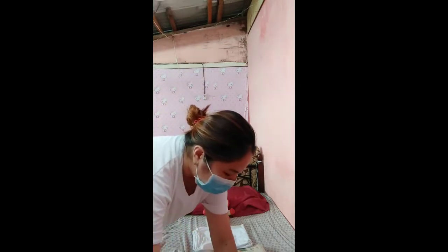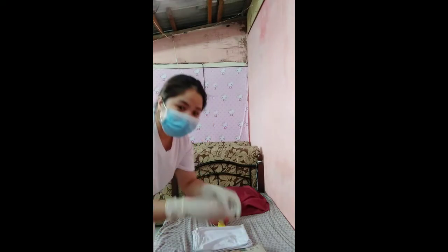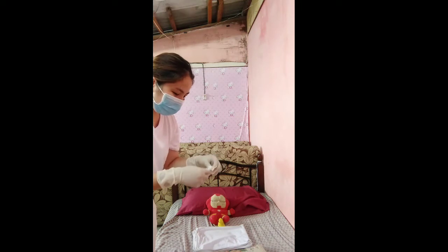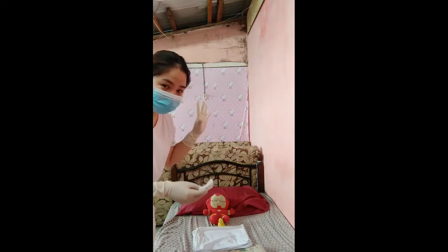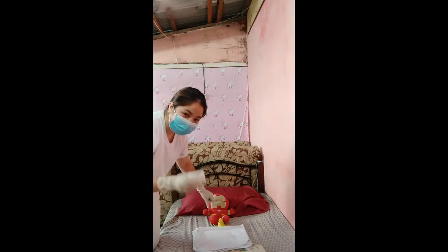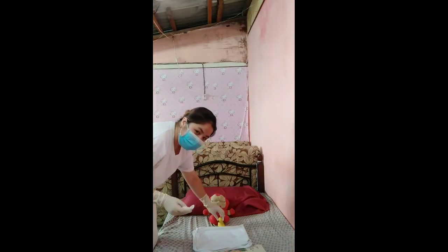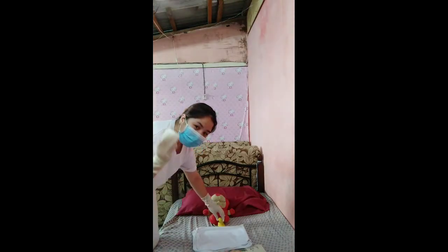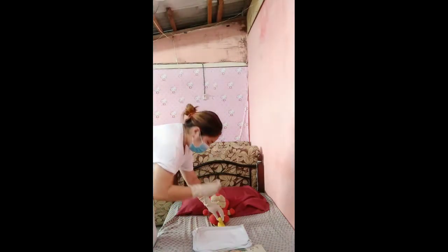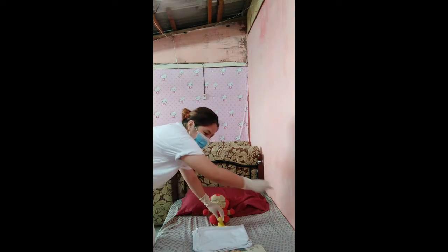So I have here 3 alcohol swabs. We assume that this is an alcohol swab. I use my non-dominant hand, and I put this on the meatus of the patient and clean. The first alcohol swab, 1 circle only, then discard.